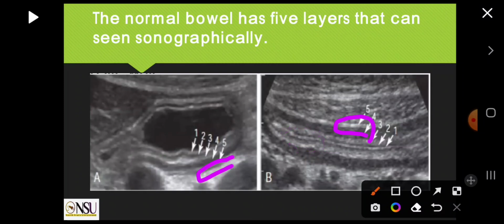After the mucosa is inflamed، بعد ما يحصل لك التهاب في طبقة الميكوزا اللي بتسبب هي الاستفراغ أو ما يسمى بالمعوية بشكل عام sometimes، بتلاحظ إن في زيادة في السمك أو في السيكنس بين الميكوزا layer internal وهي ما يسمى بالكولايتس. End.